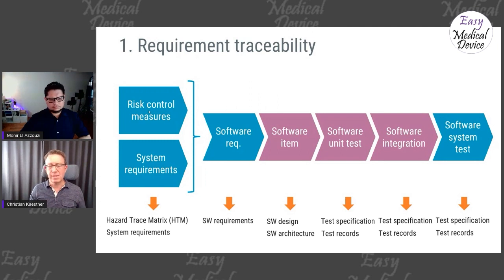What often happens here is that instead of having a structured way of managing your traceability, all this information ends up in different documents, sometimes even disconnected from each other. So you have to take one document and then you have to read through another one. And somewhere, let's say about software requirements down to the pink or purple colored boxes here, you start having trouble to follow the traceability. So watch out when you create a lot of documents. Make sure they're tied together.